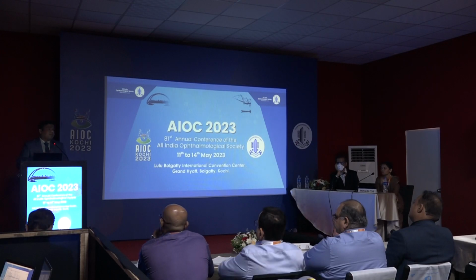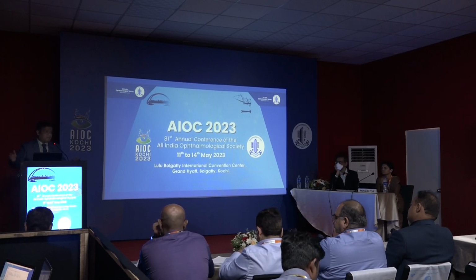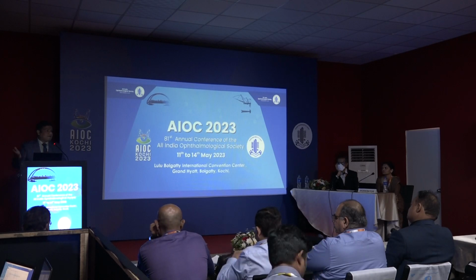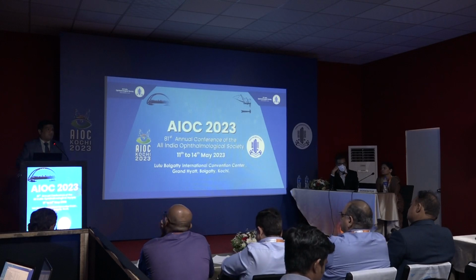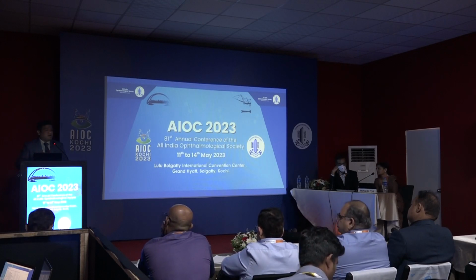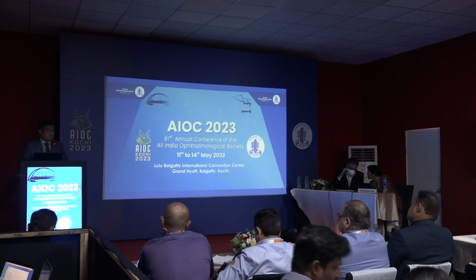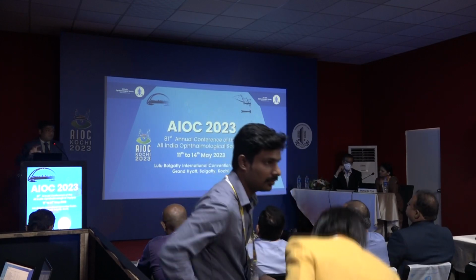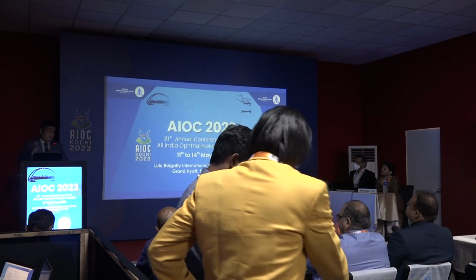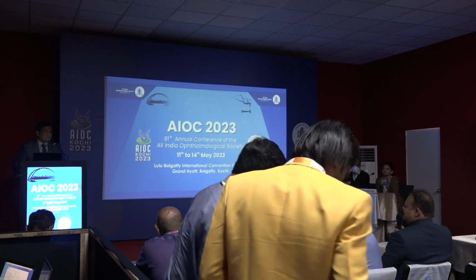Secondly, sir, in CSR, the extent of CSR is very important. A lot of times in a single scan, if it's a huge CSR, we might even miss the peripheral extent of the CSR. We might miss some PEDs which are present outside the scan area. So this will show the PEDs or the extent of the CSR. If it's a shallow RD mimicking a CSR, we might be able to know that it's not a CSR, it's a shallow RD, because it's going outside the arcades. Now we have to properly examine using IDO again to see how far it is, if there is a break or not. I think in peripheral PCV, this can be used.